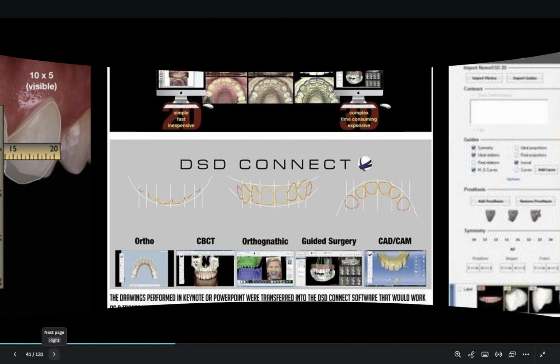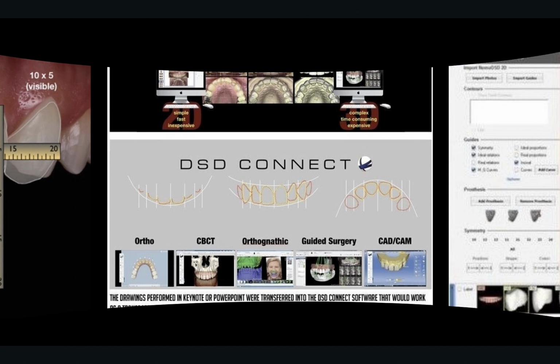We had CBCTs, DICOMs, actually being able to export out of their softwares and turn those slices into an STL that then could be overlaid with an STL of the actual model. So then you had an even further understanding of the relationships between bone, tooth, and gingiva, and the gingival complex. The ability orthognatically to be able to see in context where in the face things were seated.